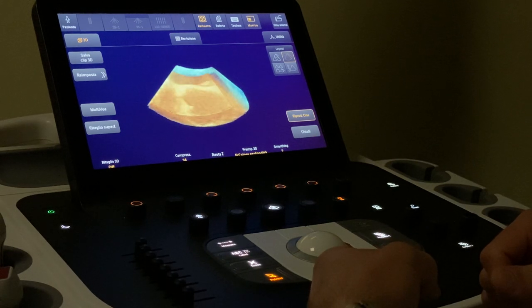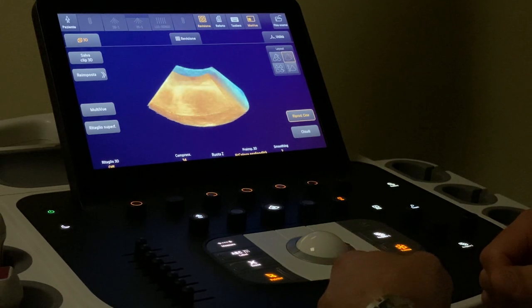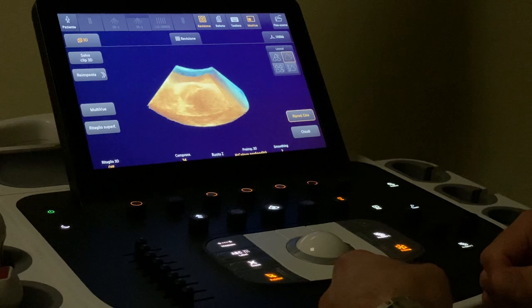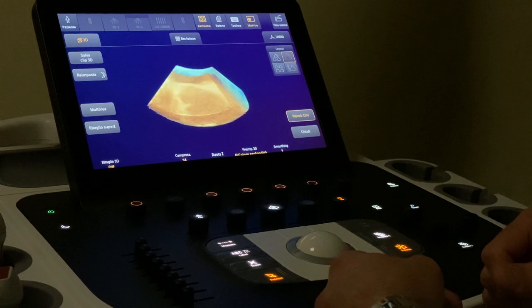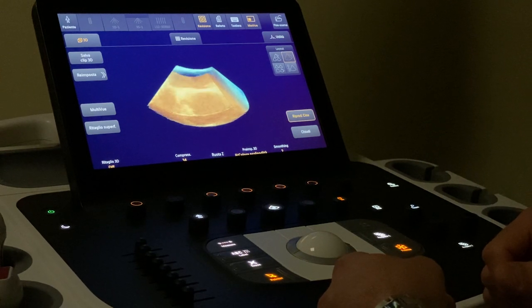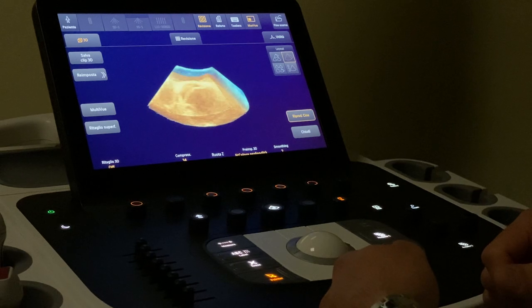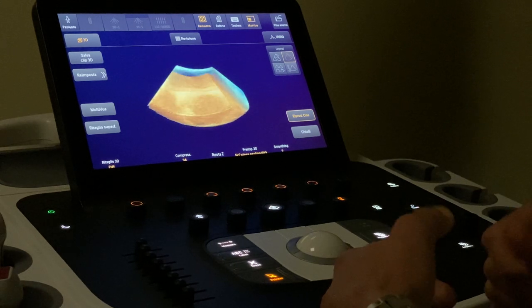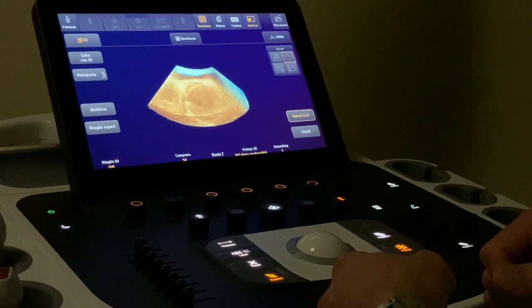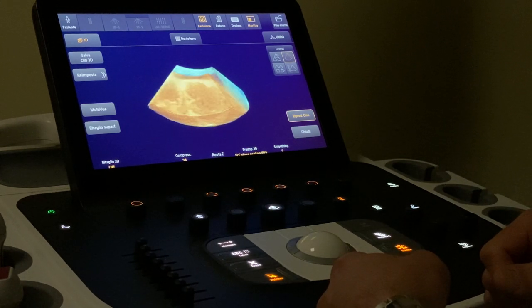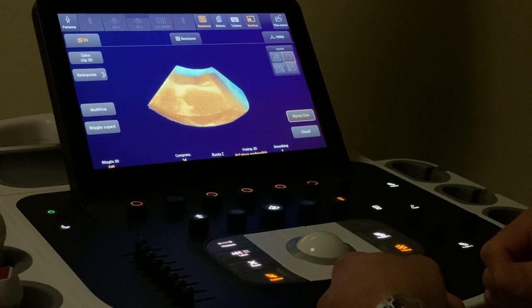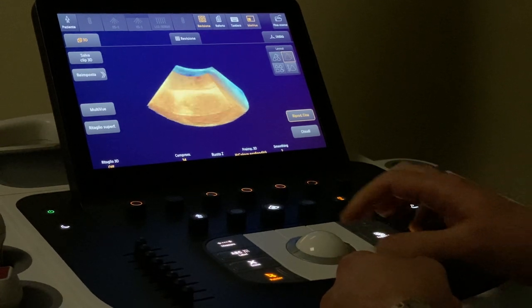In this video we will see how we can edit a 3D acquisition at the transesophageal echo. This is a 3D dataset of a normal mitral valve without any significant regurgitation.